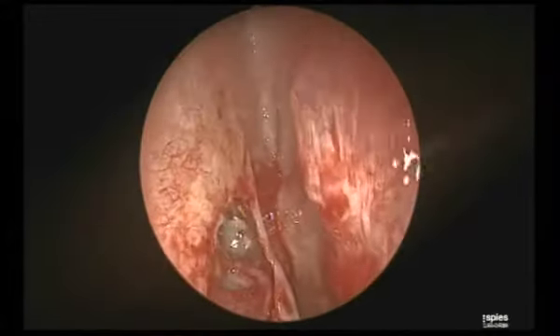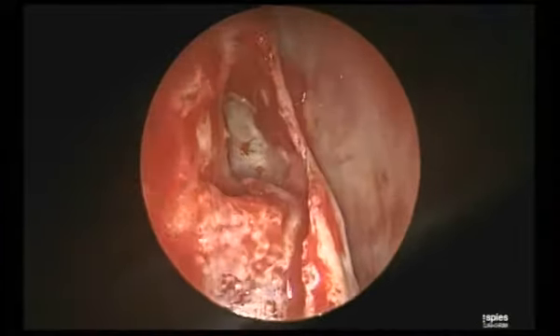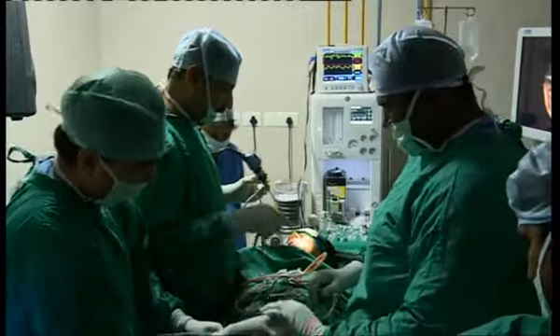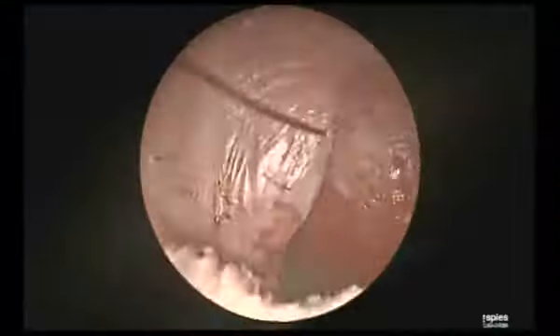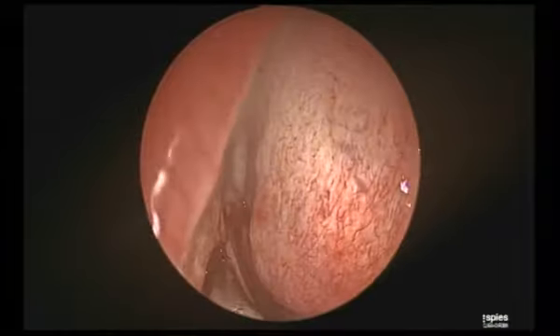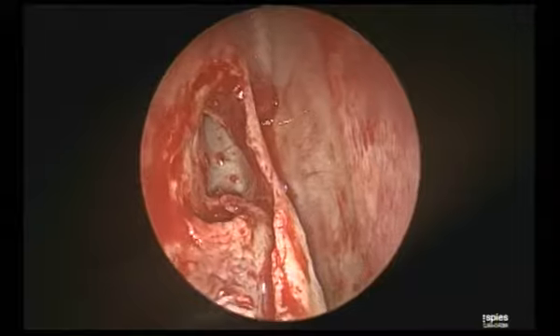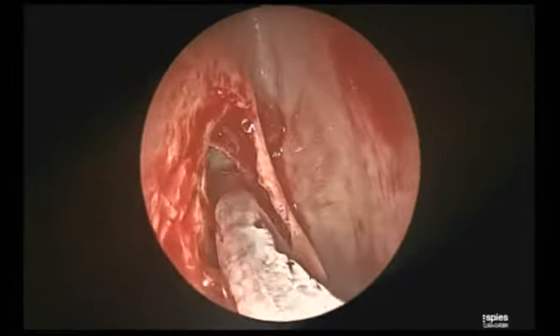Now, once I see my lateral and medial limit, where do I have to go? Only anterior. Anteriorly to define my most important limit, and that is the beak. I will never be satisfied with the frontal unless I flush with the beak. If I don't do that, I may sometimes mistake a cell for the frontal sinus.